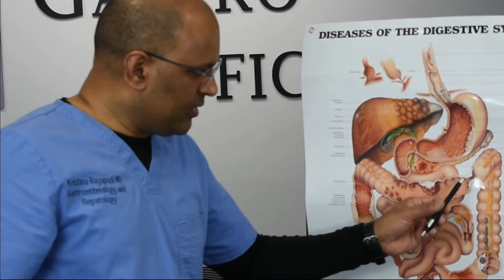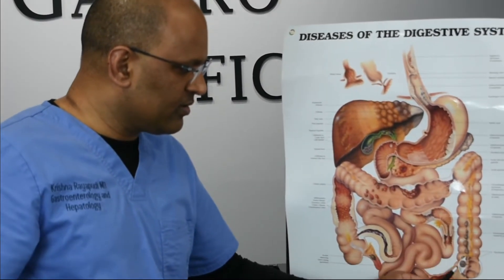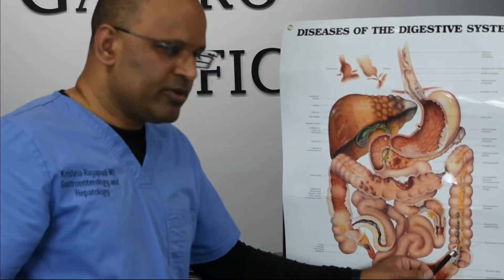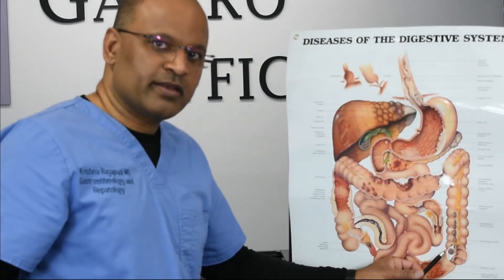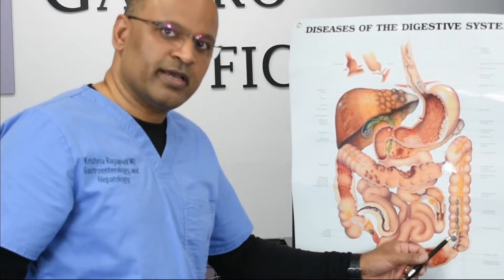We can also look for diverticuli. You can see these pouches in the colon. They can trap your stool and get infected at times, or rarely cause bleeding too.